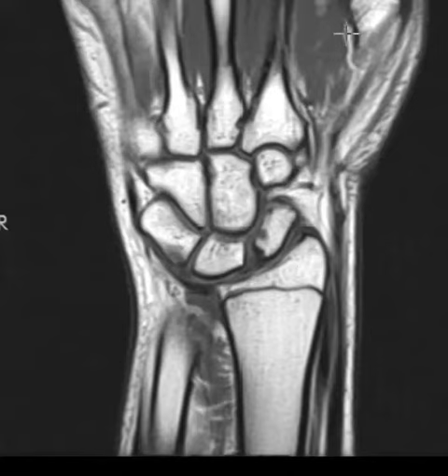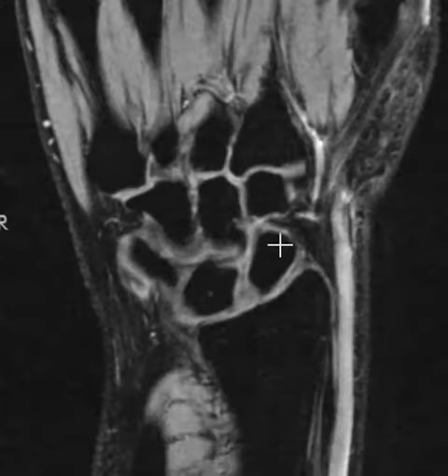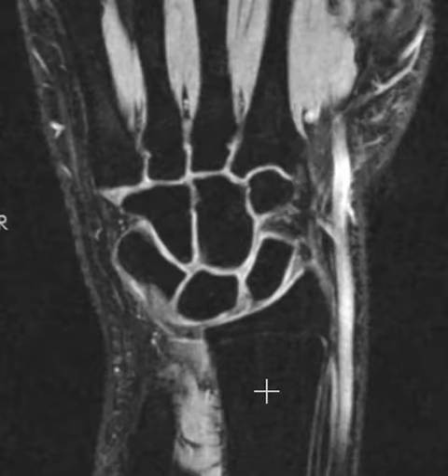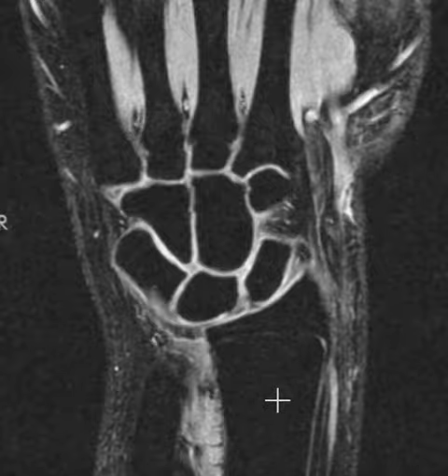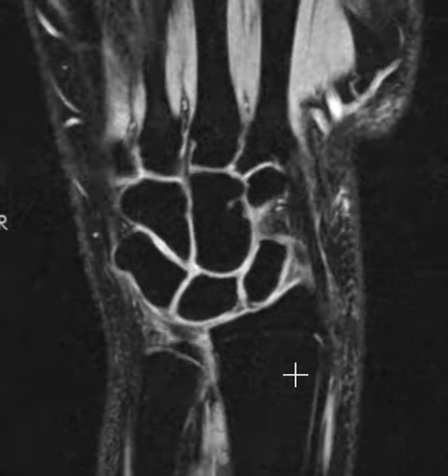Now, there is one other thing. She has lots of swelling around the base of the thumb, and this is where she's hurting. There is one other finding near the scaphoid bone — again, they thought it was fractured, so there is pain in this region. We're going to put up a gradient echo sequence where marrow is dark, looking almost jet black, and this helps us see ligaments in very thin images. I have an arrow here pointing to a ligament.